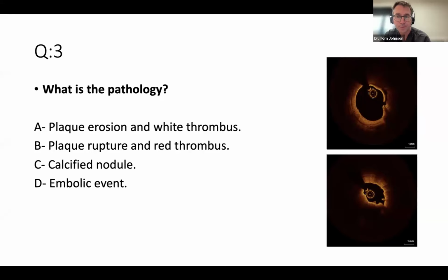Yeah, how about the 7 o'clock area? I thought it's like a small... So again, because we're kind of at the outer boundary of where the vessel is. So no, the 7 o'clock, you've actually got an area with a slightly higher signal, which is right on the lumen surface. And if anything, you probably have some attenuation that's behind that.